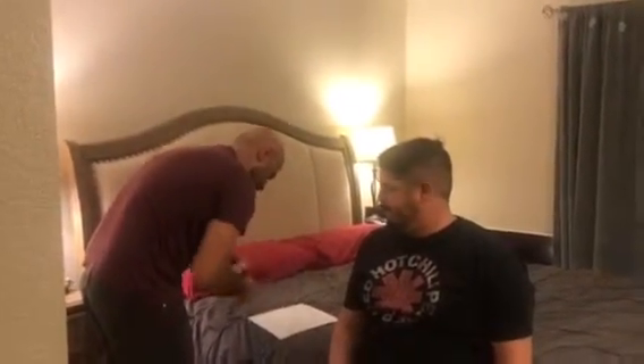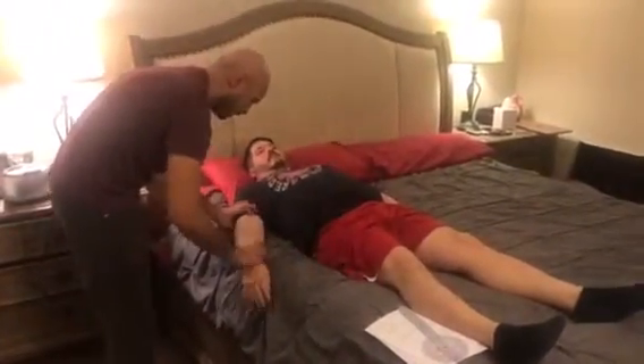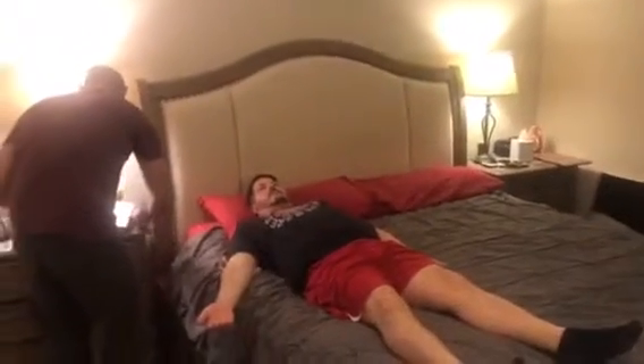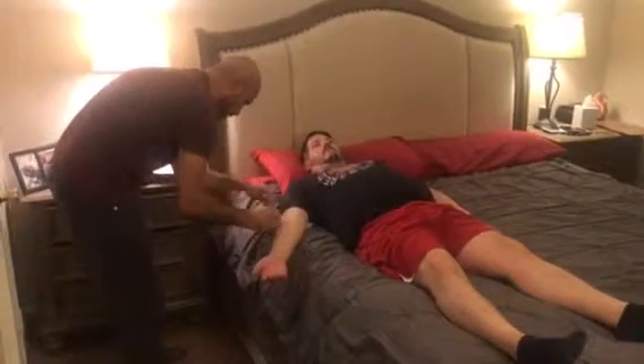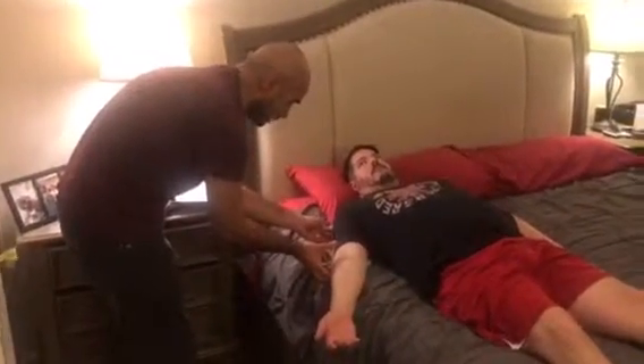On this one we're going to be in a supine position, so go ahead and lay down on the bed. I'm going to put a towel right under your arm and have you palms up. We're going to have the fulcrum right about the elbow joint. We're going to have the stationary stick right across the shoulder where the acromion process is, and go ahead and bend up.